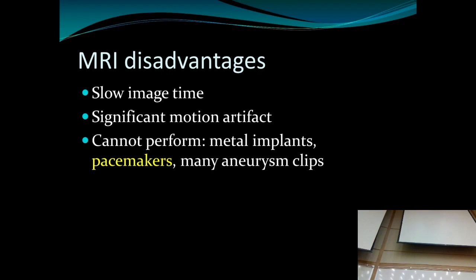So if the patient has shrapnel... We just saw a patient a few weeks ago, and MRI was really important. It was just critical, and he's had a piece of metal for 30, 40 years, right under the eye. And the radiologist was saying, boy, if that moves, this could be devastating. So we should have plastic surgery come and take the little metal piece out, and then he could have the MRI scan.